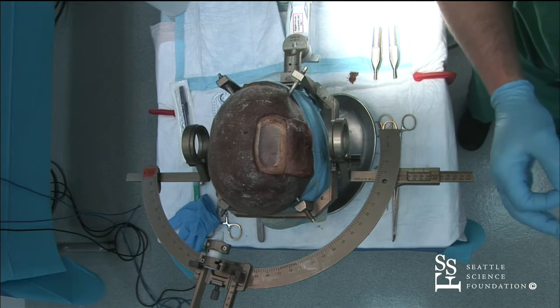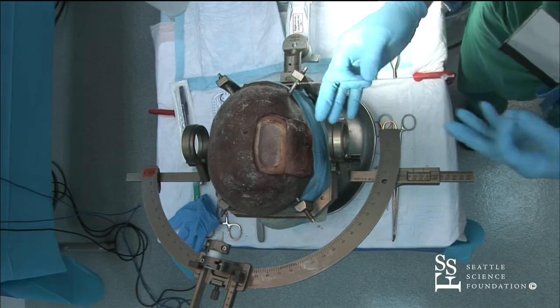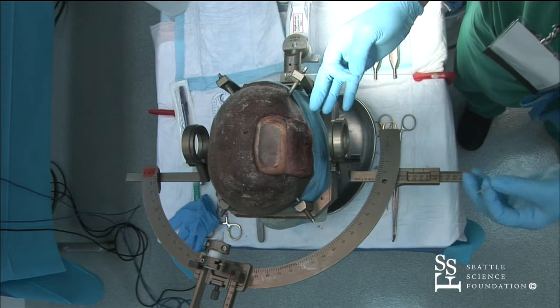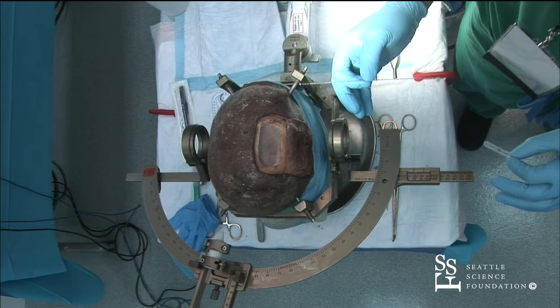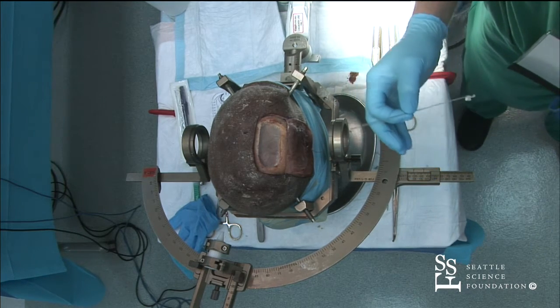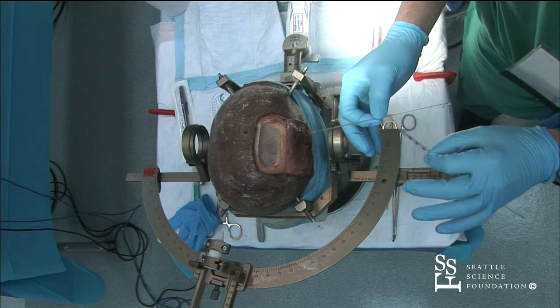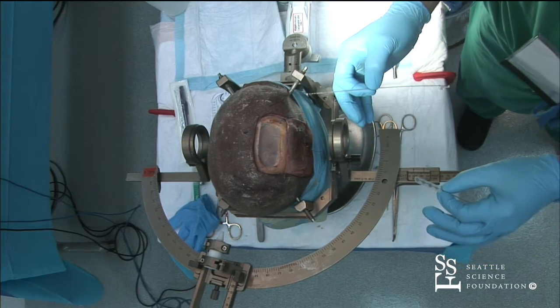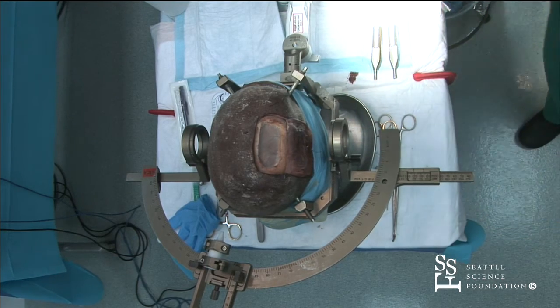Complicating things would be any previous surgery that they've had for epilepsy. So oftentimes they might have already had a craniotomy done, and you might want to use the previous craniotomy as an access to get it there. That can make it a little more difficult if there's scarring or anything. But ideally, you're making a fresh burr hole and sliding it subdurally, and then typically just tying it and tunneling it from there. So that's the strip.